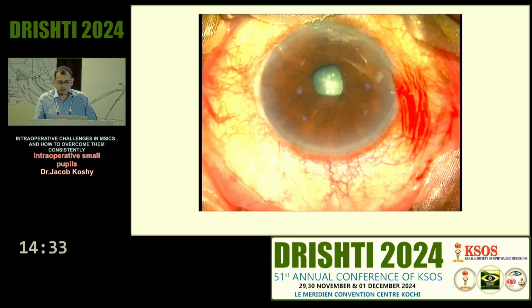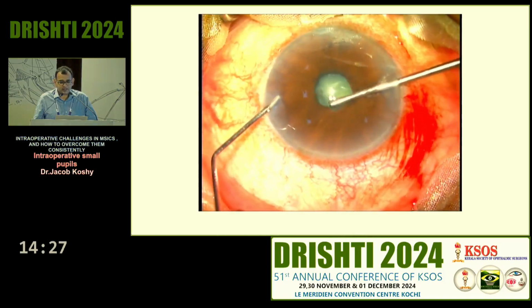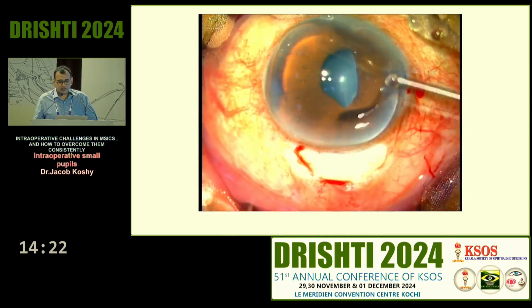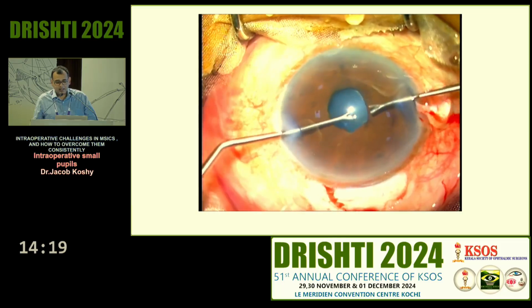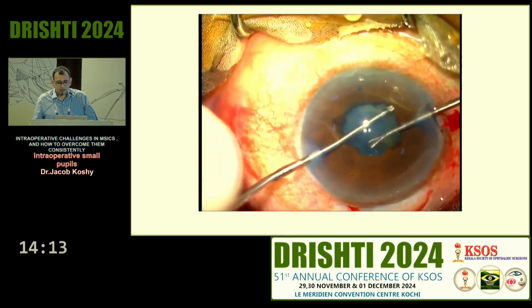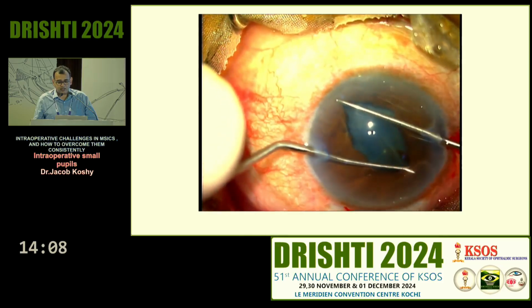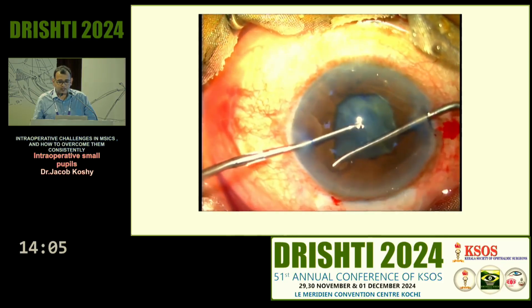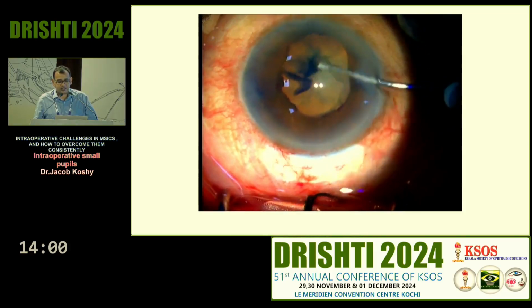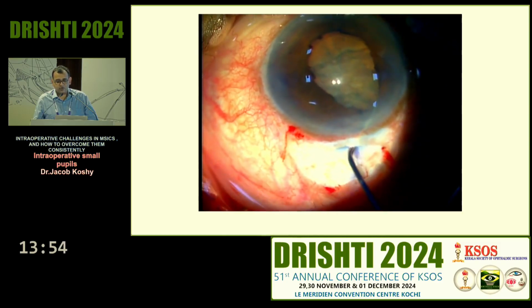So this is another case that we see here, again a small pupil, and so I'm following the same technique that I said, where I first check to make sure that there is no synechiae. You put some viscoelastic. I've put a little bit of blue as well, and I go to stretch the pupil. The 2 side ports should preferably be 180 degrees apart, so that you have better maneuverability. I always make it in 3 different areas, and that gives me a fairly large size. You can see here I'm doing an SICS case, and you can complete your rexis there. Most of the times these go pretty well.